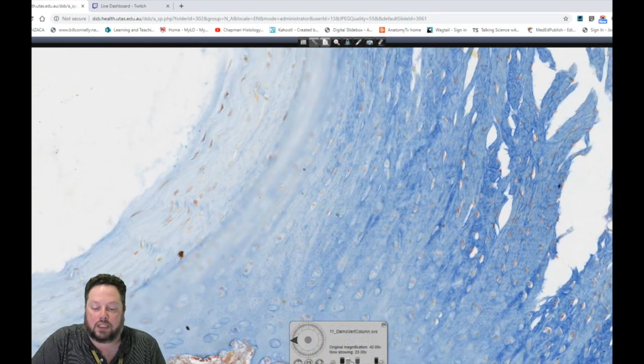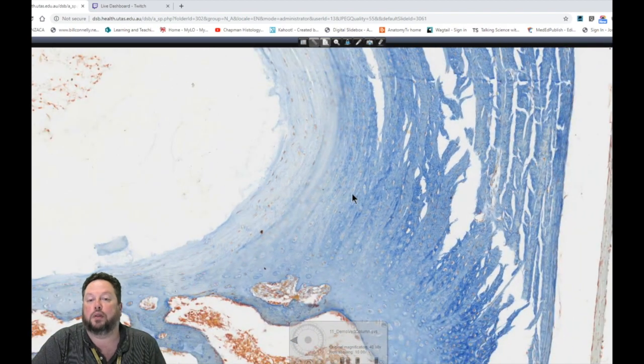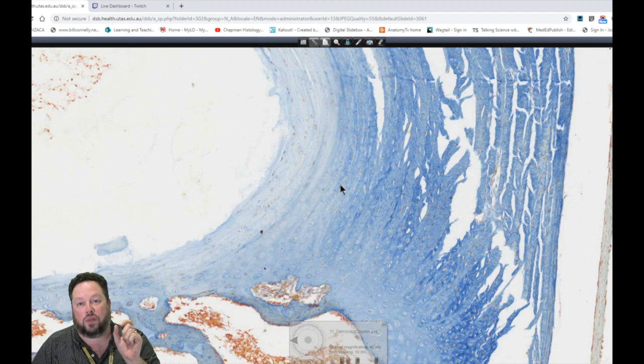Fibrocartilage is often thought of as an intermediary between hyaline cartilage and dense connective tissue because of the abundance of bundles of collagen fibers, providing a very strong structure. So we find fibrocartilage where we want just a tiny bit of flexibility. We don't want the same density as bone. We want a little bit of flexibility, but we want to resist most forces. Obviously we don't want our vertebral bodies separating, because that leads to paralysis and other sorts of problems. So we find it in areas where we want a nice strong bind but a little bit of flexibility. The intervertebral disc is one example.